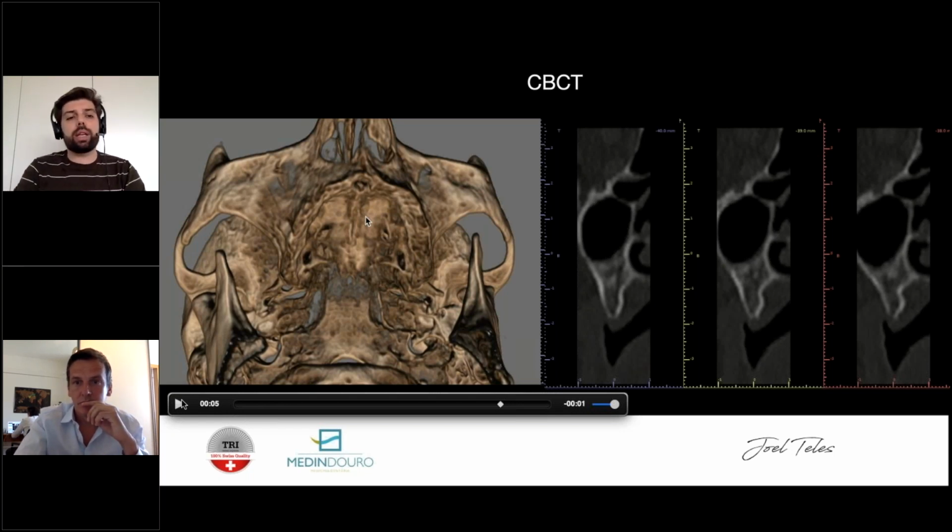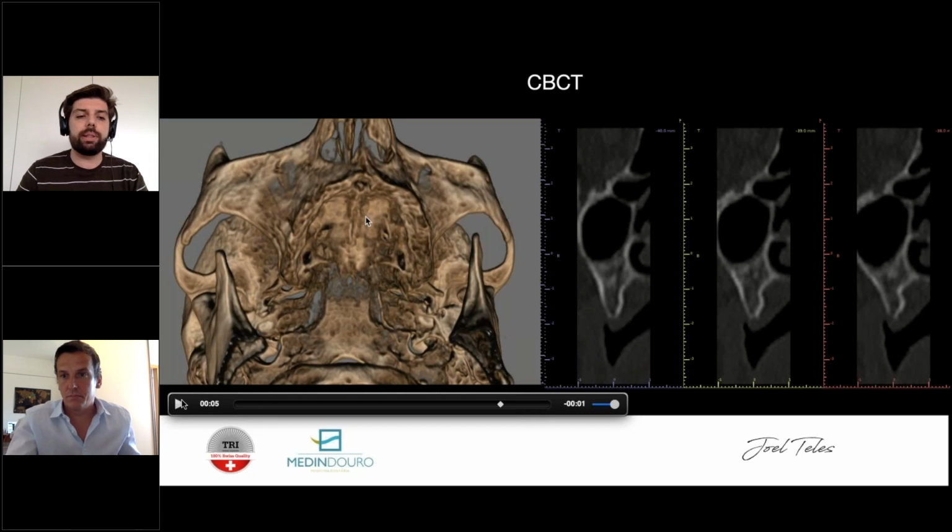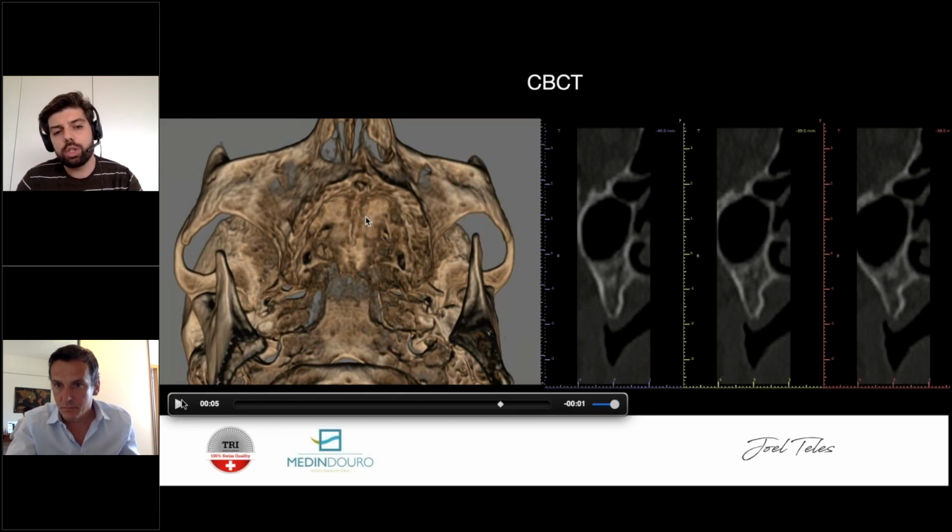If he's talking about zygoma, again, higher morbidity, way higher costs, and a need for a surgical room. That is not always like this, but it is a thing to consider. And the leverage effect on zygoma implants is something that I really do not like all that much. So in long-term results, if I can avoid them, I would. And in this case scenario, yes, there are some other options. So I would not go zygoma. Okay, and that answers that question. We had this zygoma question from Barry Rimmer as well.